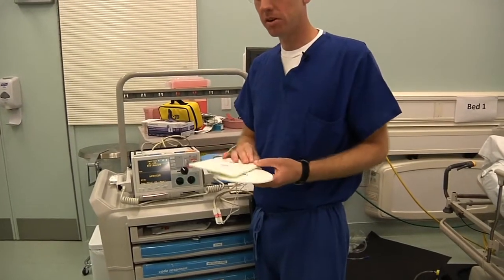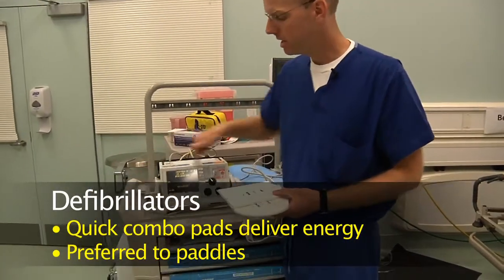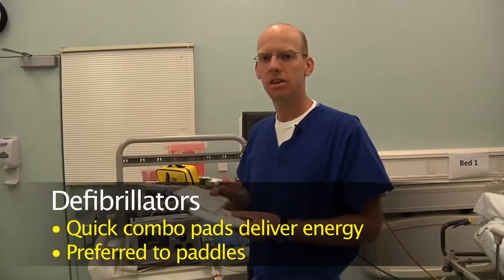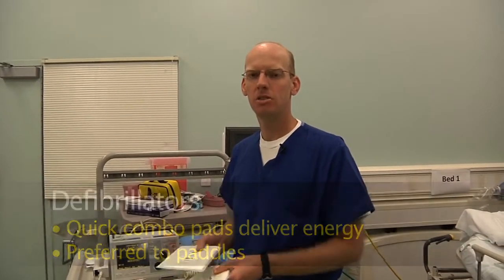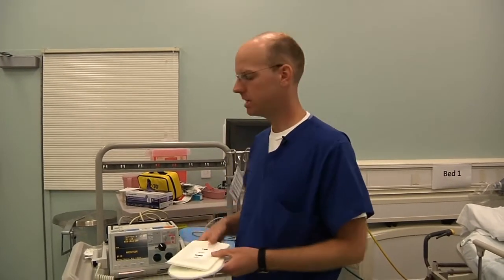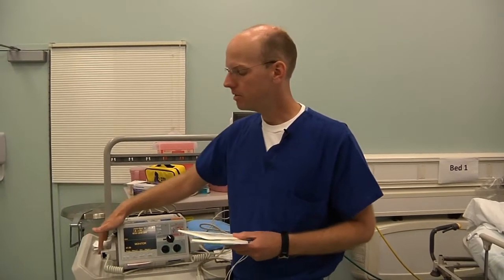These are preferred over the paddles. So these are pads, these are paddles. These are preferred because they're already on. You can continuously monitor the rhythm with them, you can shock through them, you can pace through them, and there's no delay in CPR when you have to go on and off the chest, which you'd have to do with the paddles. But sometimes if these fail, you can use the paddles.